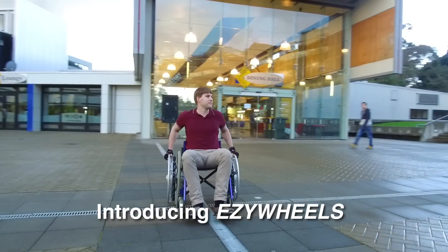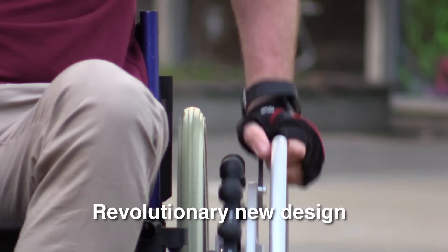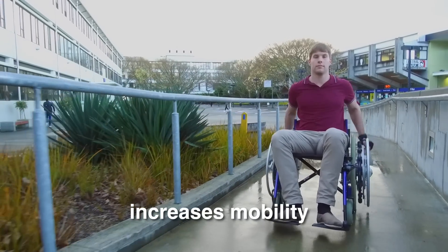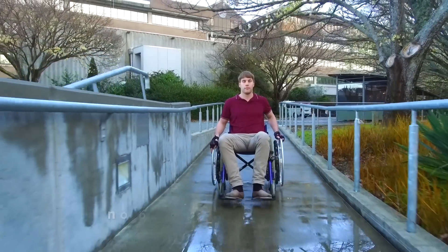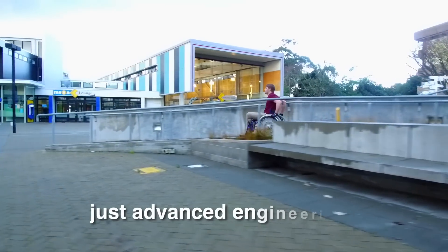Introducing Easy Wheels. It may look like your standard wheelchair, but this new prototype is anything but standard. It's moving like any other chair, right? We'll take a closer look. Push and pull — your standard wheelchair is just push, a movement which is not only inefficient but painful, with users experiencing pain in the wrists and shoulders after just one year.